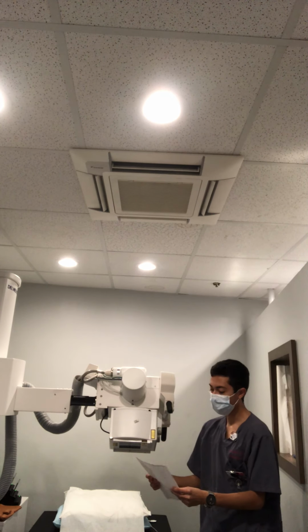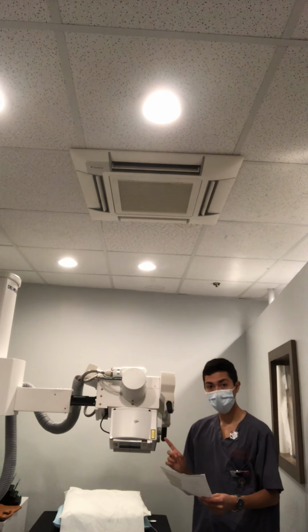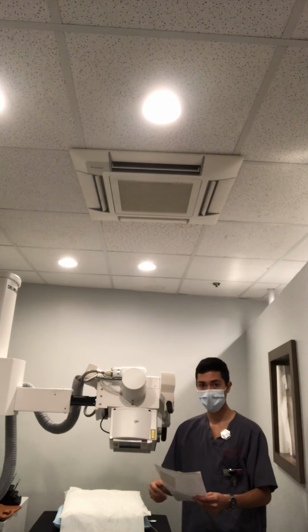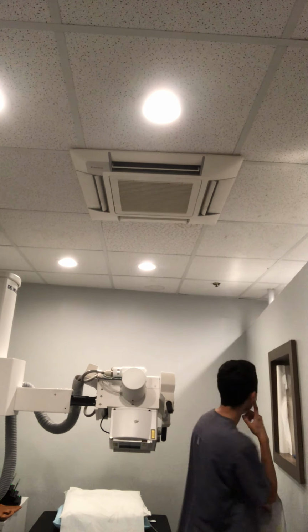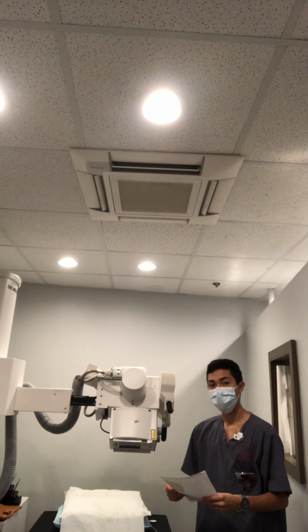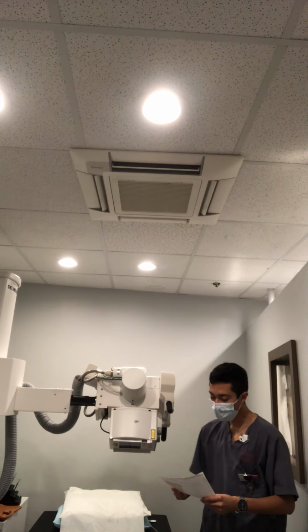Okay, the first part is pathology of structure shown. We would do the TMJ closed mouth, which means the condyle would be in the mandibular fossa, right? And for the upside, because you're kind of going like this. Okay, I'll explain later. Okay, the IR size and placement. We would do at least an 8 by 10 or 10 by 12, depending on the patient's size.